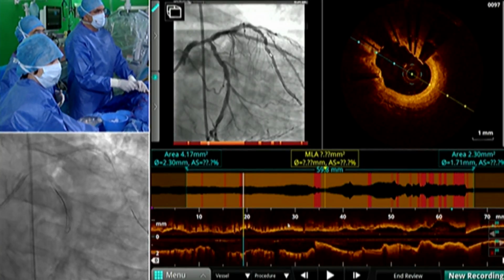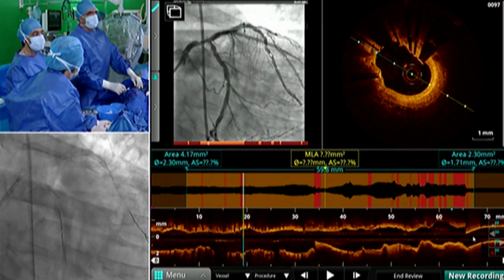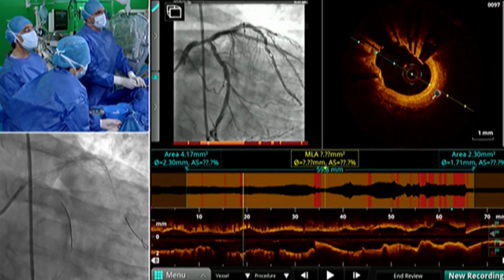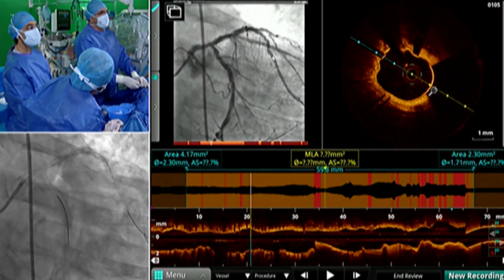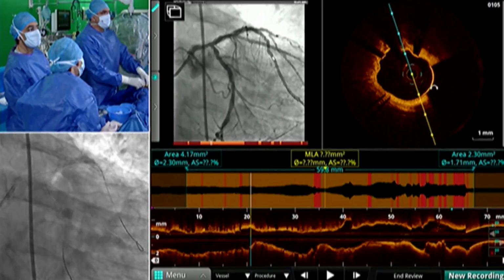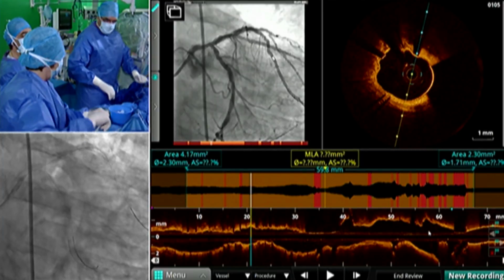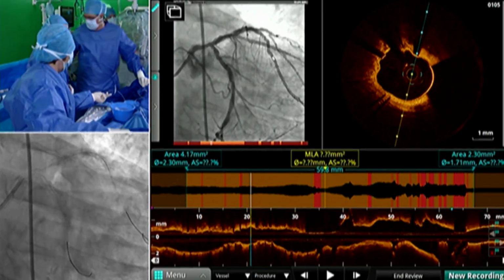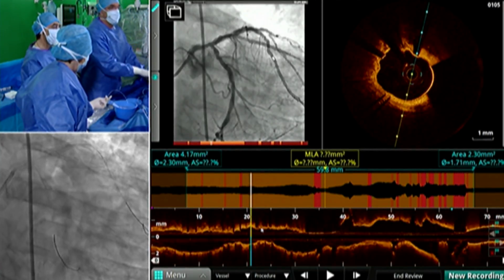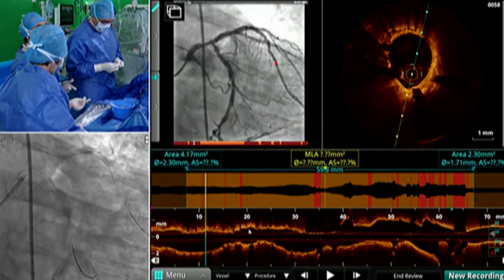Below you can see the longitudinal view, 75 millimeters along the vessel, starting from the guiding catheter, then the left main. Then, turning a little, you will see the bifurcation. At this point you may see the circ while Jean is working. This is the bifurcation with the circ and the intermediate branch. Then we are entering the LAD, arriving in the distal part of the scan inside the stent. The stent was placed many years ago.